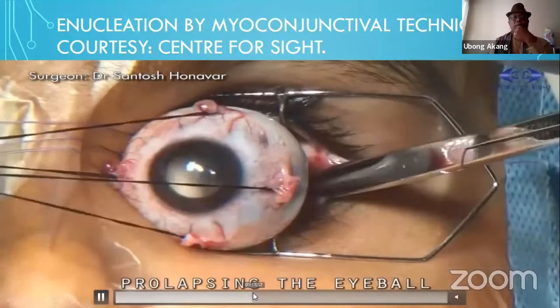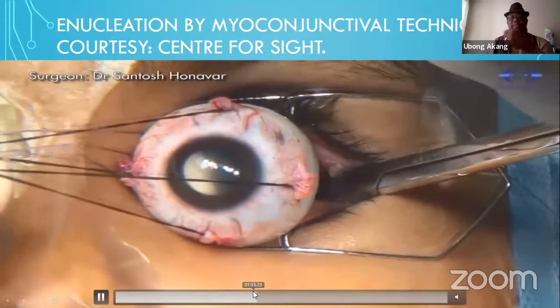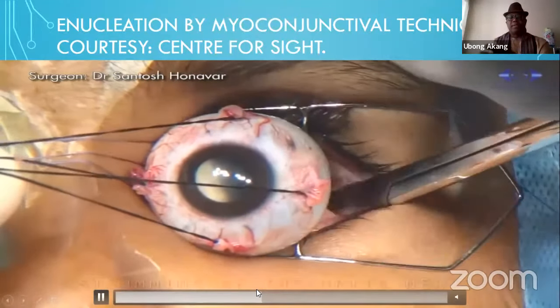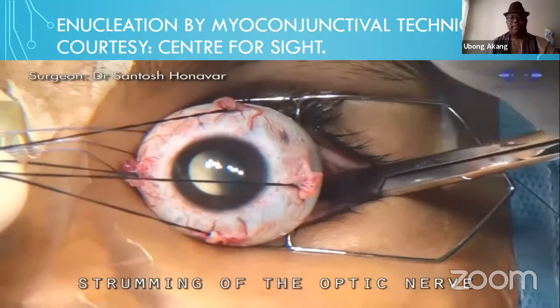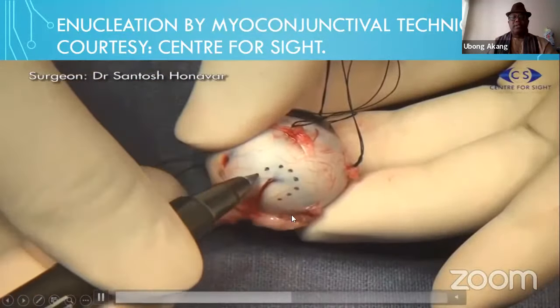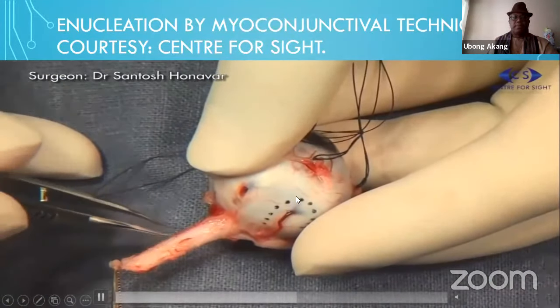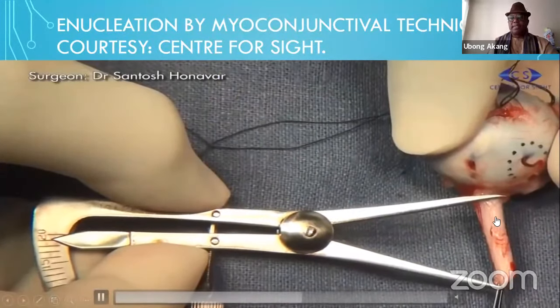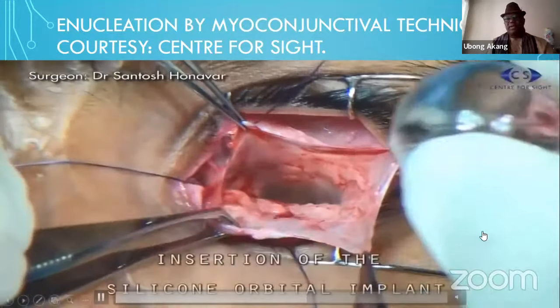You support your globe with the tag that you did earlier on. And then you go for strumming at the optic nerve so that you can get a longer optic nerve length. That is the strumming being done there before you cut it. After cutting it, you now inspect your globe. Take out at least 15 millimeters; you can take up to 25.